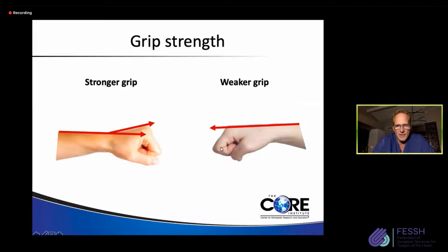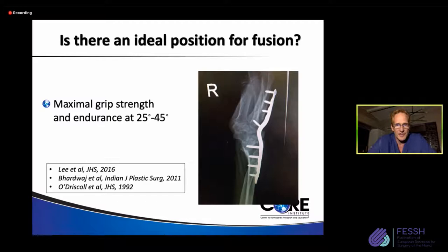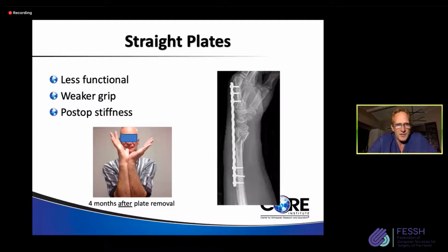So what is the ideal position for, in this case, a fusion, and this can apply to spanning plates, is that it has been documented by several authors that the maximal grip strength and endurance seem to be somewhere between 25 and 45 degrees. Now, straight plates, as we said, mean less function, weaker grip, and post-op stiffness.